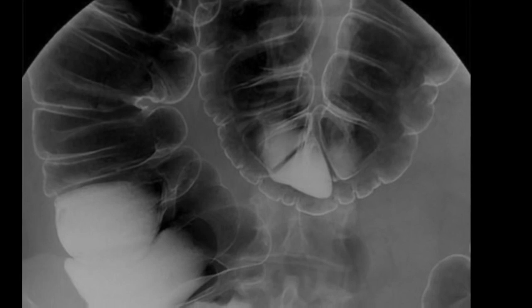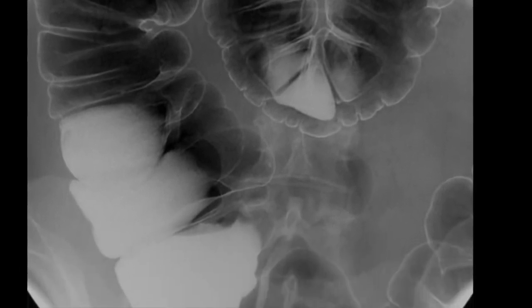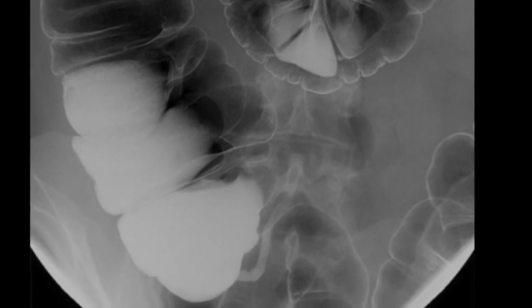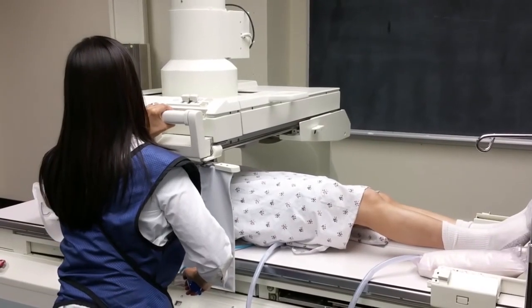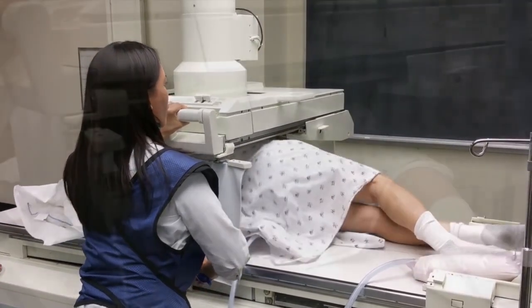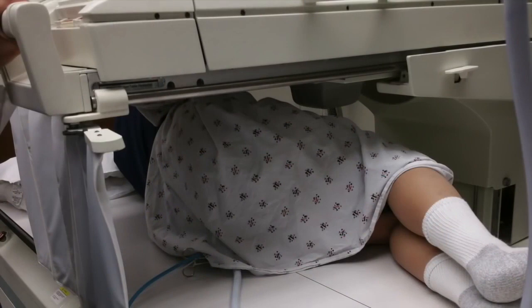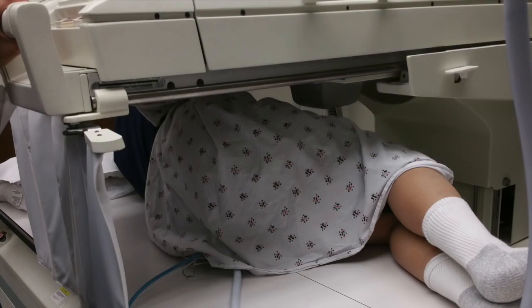If the barium isn't moving into the ascending colon and cecum with the patient on their right side or the table tilted, it's probably because there's not a large enough volume of barium. Whenever placing the patient in a lateral position, check out the proximal rectum to possibly take a good air contrast image of a lateral rectum or open up overlapping loops of the sigmoid colon.